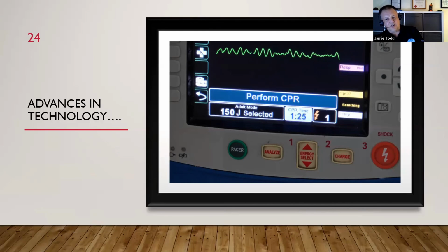So advances in technology may lead to changes in practice, and I think that's important. Also, it does impedance adjustment, so it will change the shock level depending on the patient. Yeah, some are capable of doing that. It's actually sending small shocks between the pads and measuring impedance and adjusting itself, so it's able to cope with different size patients and possibly even pediatrics. And I believe there's new software waiting for approval that means it will even analyze the type of VF and decide when the most appropriate shock time is.